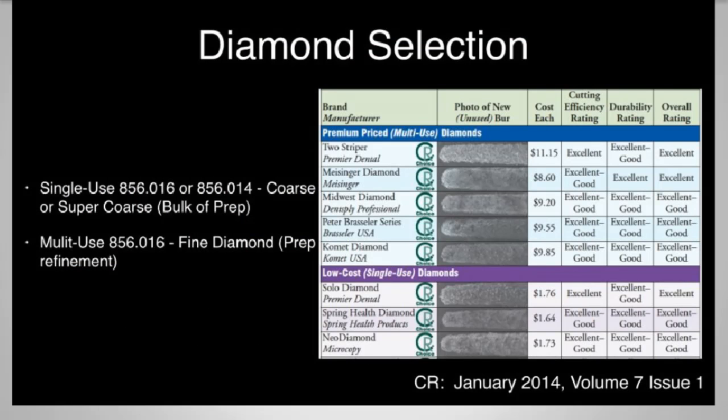Generally speaking, for my all-ceramic preparations, I use single-use burrs for my gross reduction. And single-use burrs today by companies such as Microcopy, Premier, or Dentsply perform very well and are at a very economical price point, where they're usable for most practices. In some ways, I can't afford not to use a single-use burr because they tend to be more efficient. I'm done my preparations at a faster rate.